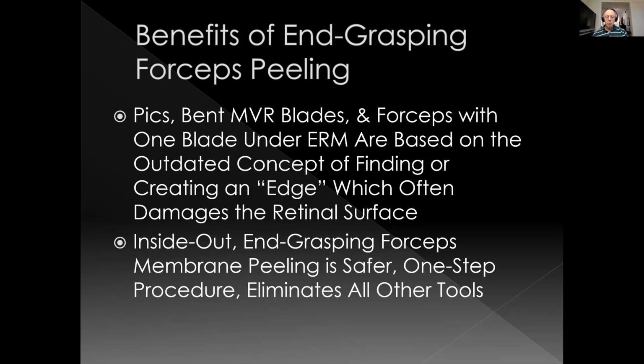So again, we want to start where? We want to start at the epicenter. What is that? How do I know what's an epicenter? If the stria in the retina point to the epicenter, that's one way to tell. It's somewhat more matte finish rather than transparent, and so it's at the apparent center.